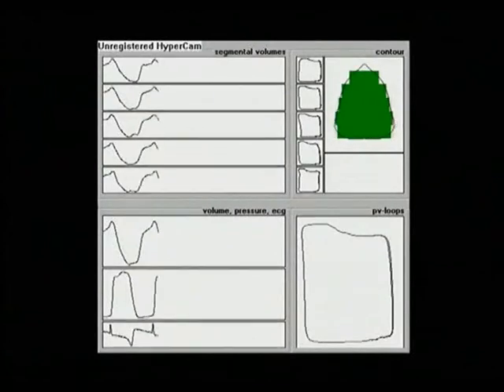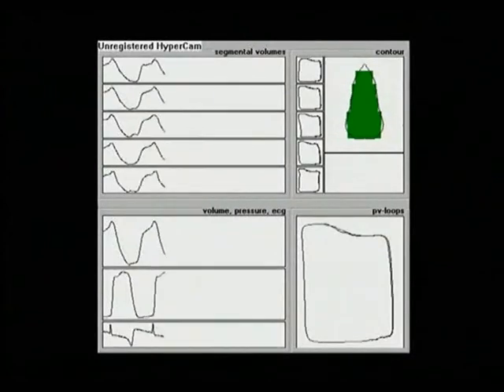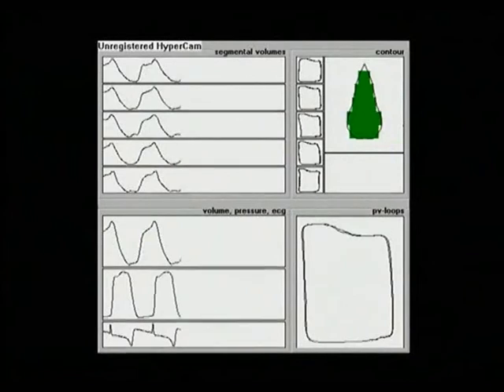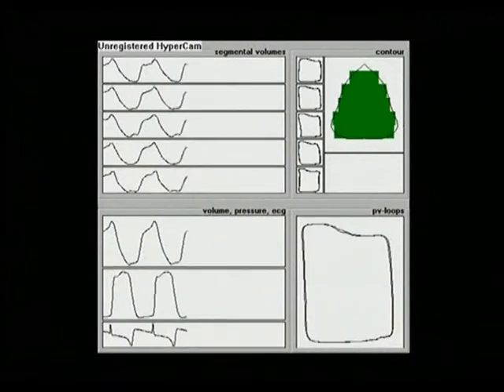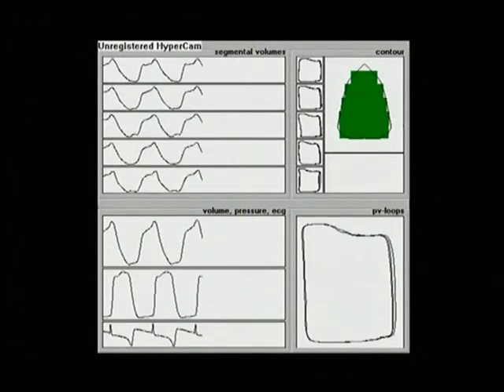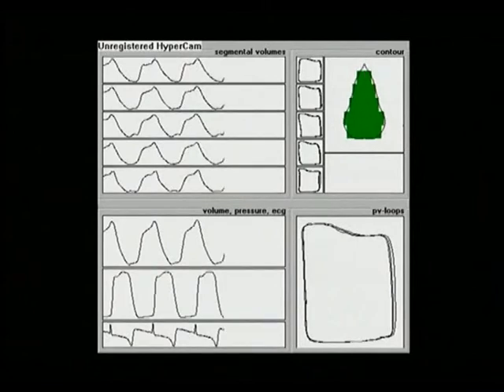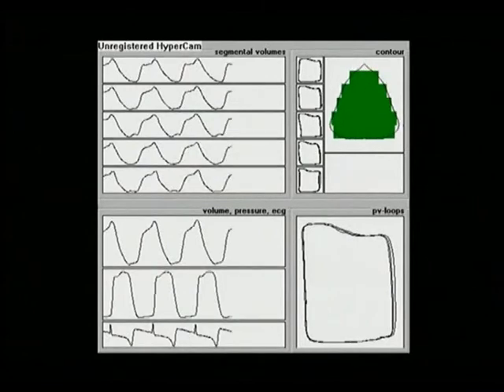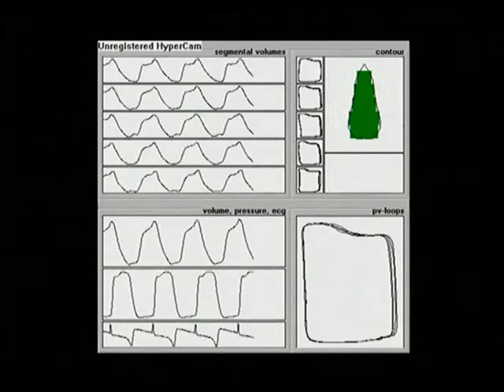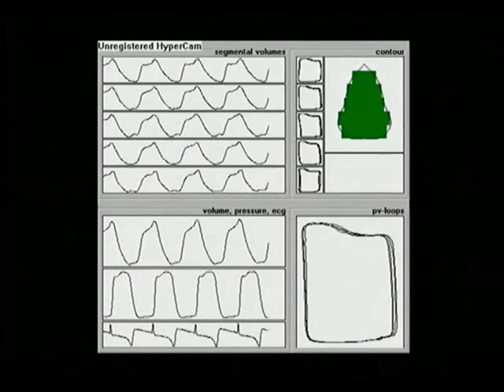On the right panels you can see the contour representing the volume variation of the five segments and the PV loop at the bottom. This allows a beat-by-beat variation of the values and to reconstruct the PV loop in real time. The total volume is calculated as the sum of segmental volumes.